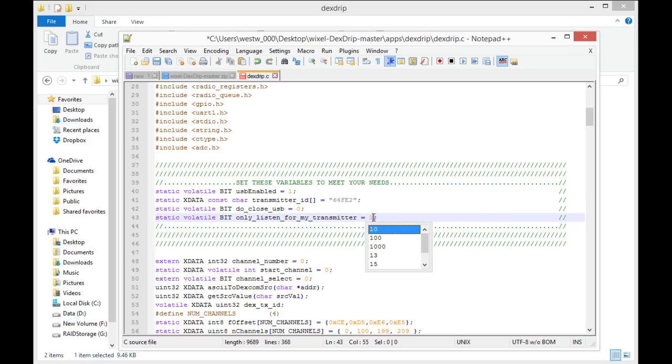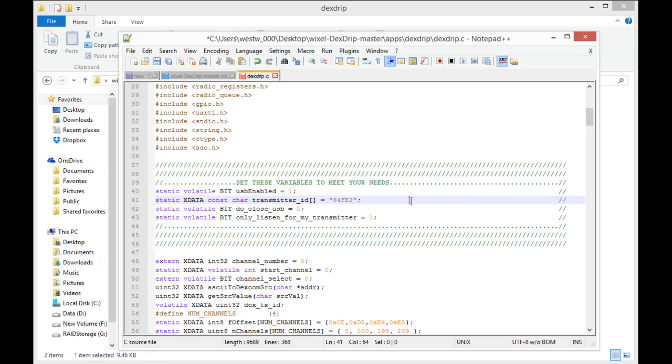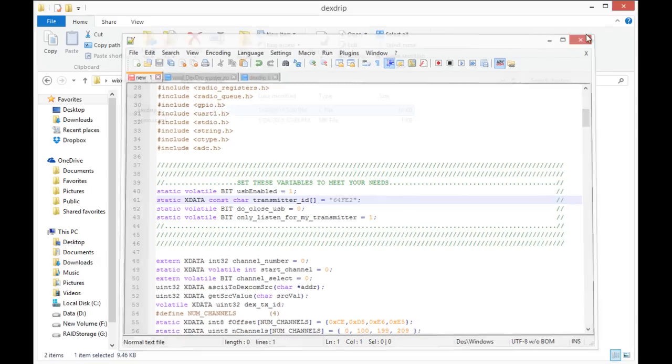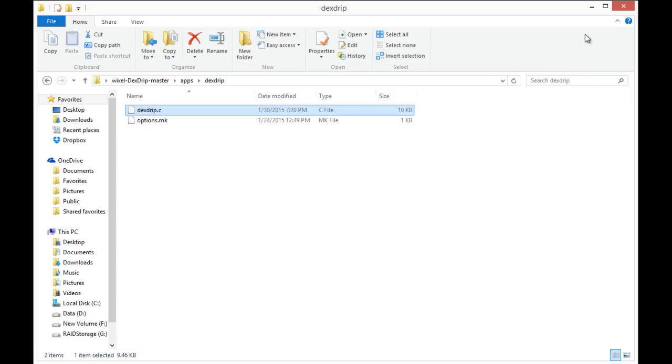And listen for my transmitter at 1. Hit save, and you can exit out. And exit again.